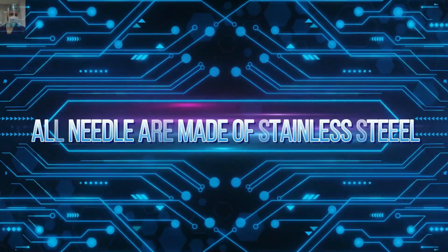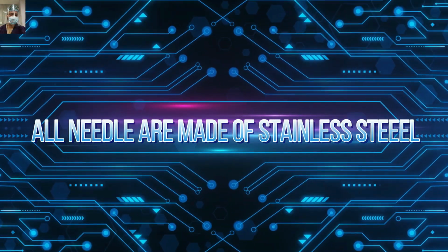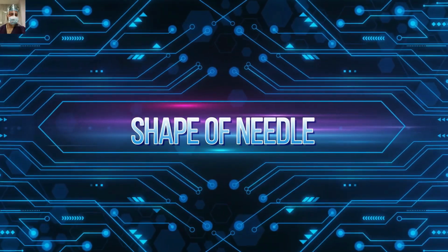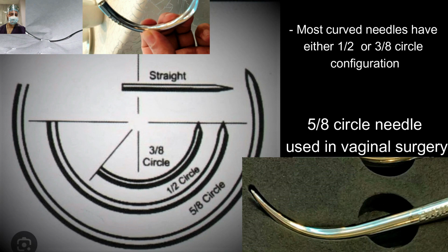So friends, for all practical reasons, all needles are made of stainless steel. Basically, there are three types of shapes available. One is the straight needle, one is circular or part of a circle, and another is the J shape, that is the ski needle. For all practical purposes, the straight needle is not used anymore; it is of historical significance only. Presently, we use circular needles only, and the circular needle can be half circle, 3/8 circle, or 5/8 circle, depending on how much of the circumference you are using.